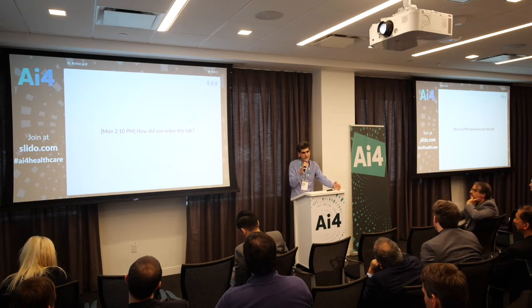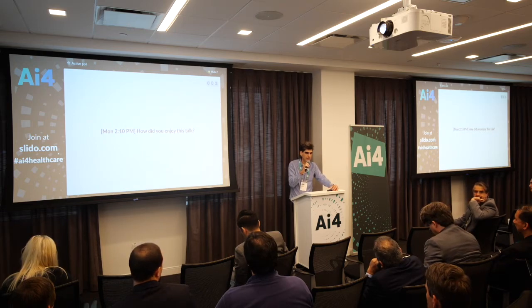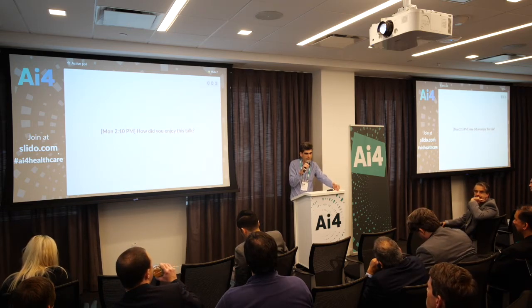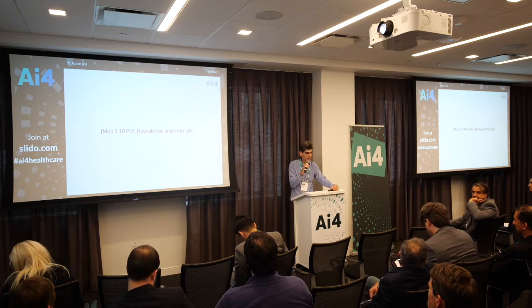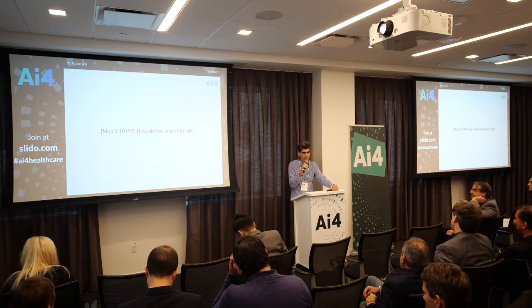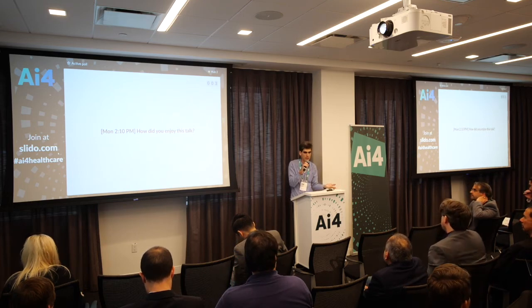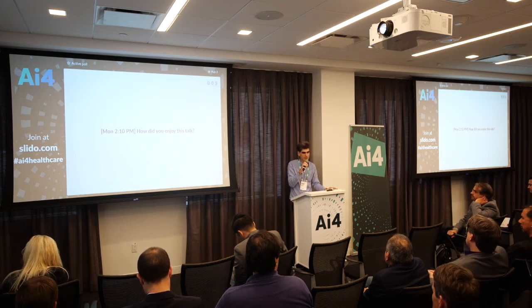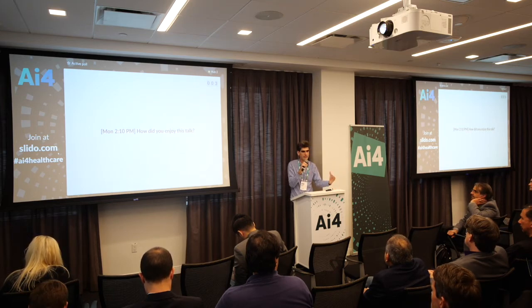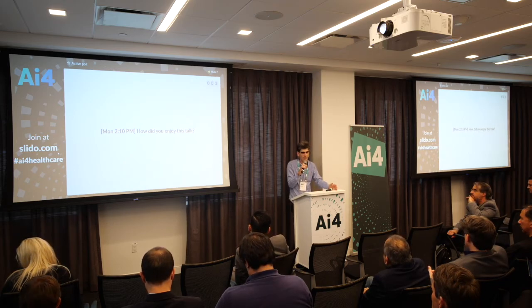If the data set is big enough, and big enough does not have to be all that big for this kind of classification task, maybe it's not measured in the tens or hundreds of thousands, it's probably measured in the thousands to get a good result, could be less, then you need to balance the training data appropriately. You don't want to train your network on a completely unbalanced data set, so you can throw only some of the negative examples at it. If you have a decent amount of examples of the cells you're trying to classify, then the imbalance in the data set can be overcome, and the wealth of negative examples can be an advantage. It doesn't have to hurt.